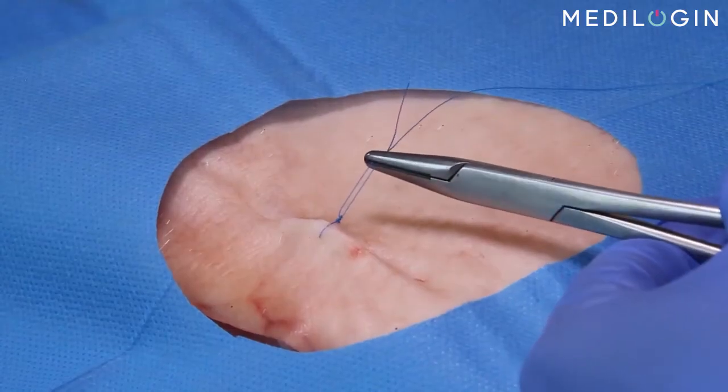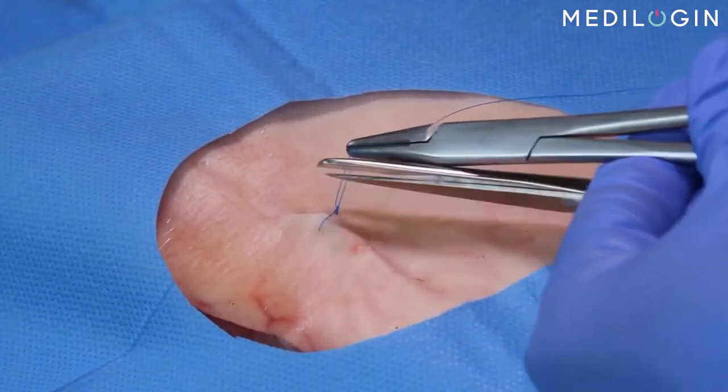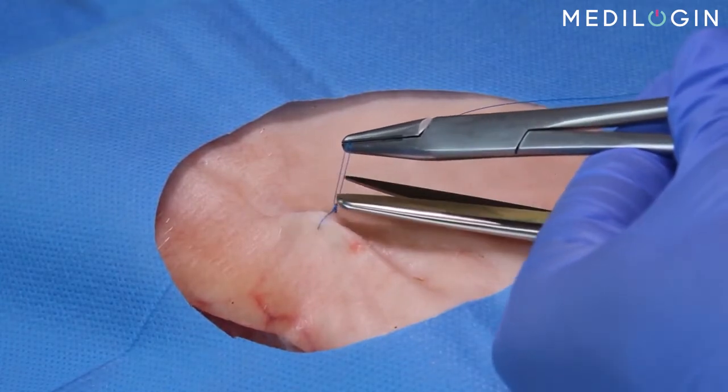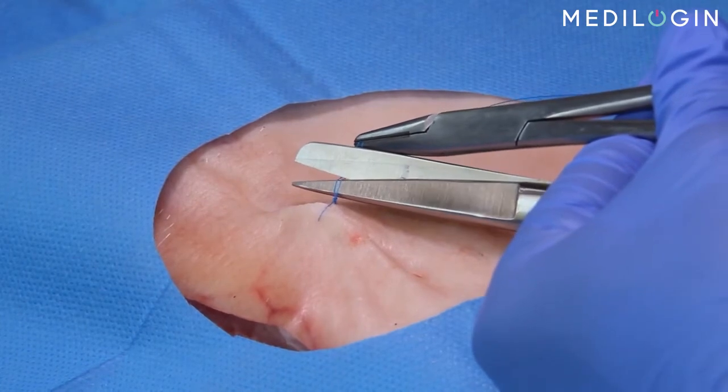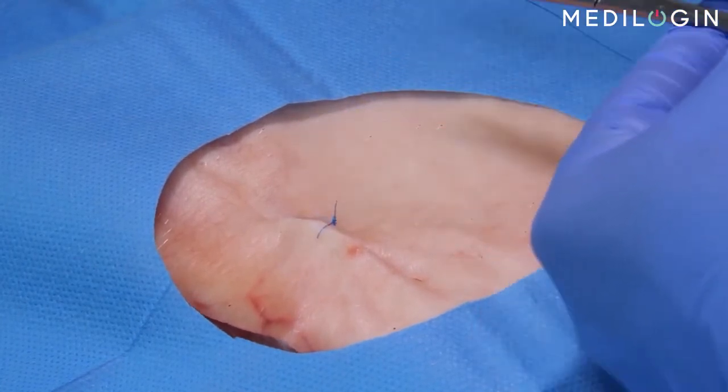Do not cut the suture directly at the knot, but at a distance of approximately 1/2 centimeter. Use the first third of the scissor blade and turn the scissors slightly diagonally and upwards.